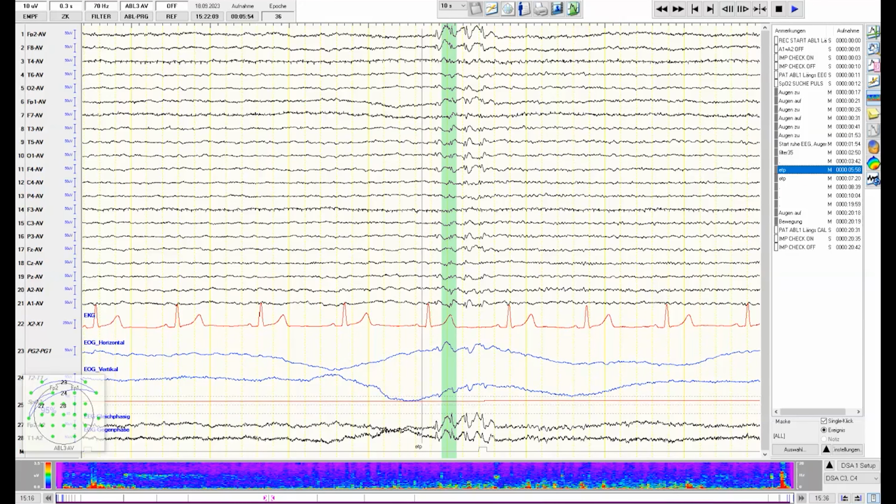And in our recordings, I see Miss Atanadova is here, who is a technician from our team, and also Anja Rüsch. I think for our setting at the PUC, we use EOG, horizontal and vertical, so you can differentiate between the both. And the second question, I forgot.